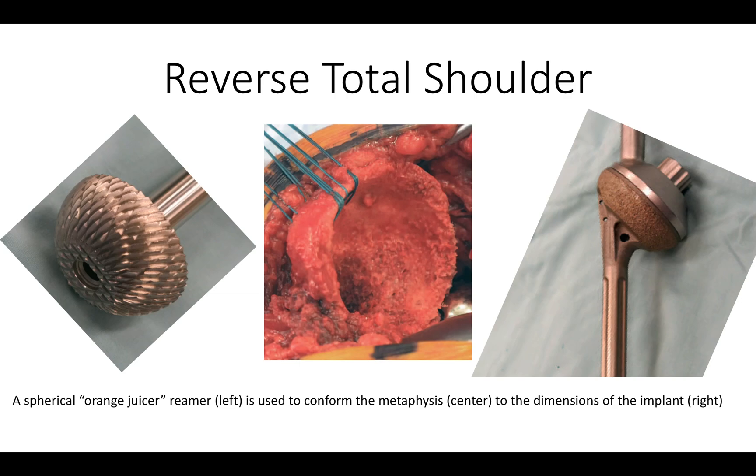After having completed the glenoid side of the arthroplasty, we turn our attention to the humerus. We use this orange juicer-type reamer shown on your left to shape the humeral metaphysis into the desired cup shape that exactly fits the shape of the prosthesis that we're going to put in it.